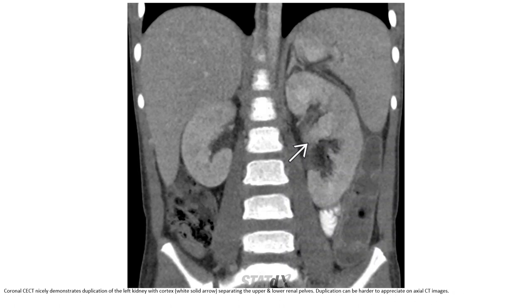This nicely demonstrates duplication of the left kidney with cortex separating the upper and lower moieties. Duplication can be harder to appreciate on axial CT images.